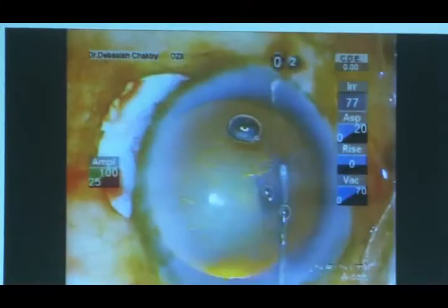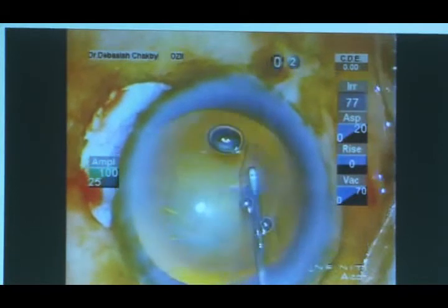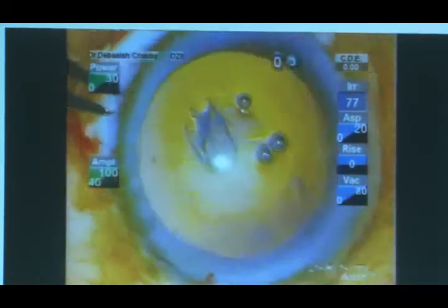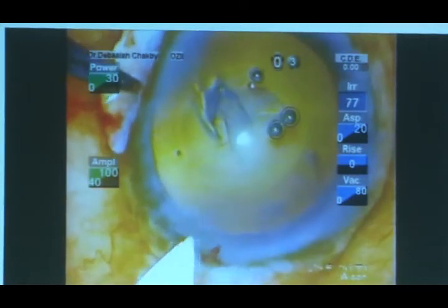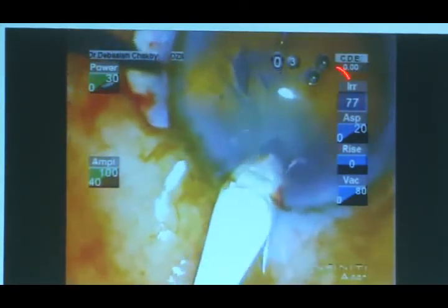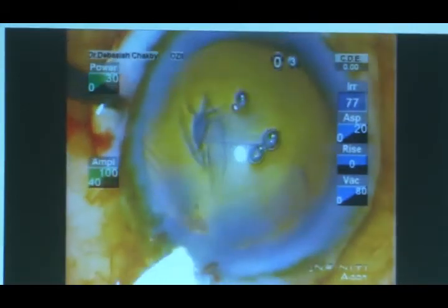After the mitomycin C is washed, the surgeon now moves to the temporal part. So this is a two-site trabeculectomy. We go to the temporal part and we complete the rhexis. The size of the rhexis should be slightly smaller than what we do in a routine phaco, so that in case there is a postoperative shallowing, the lens does not come out of the bag.